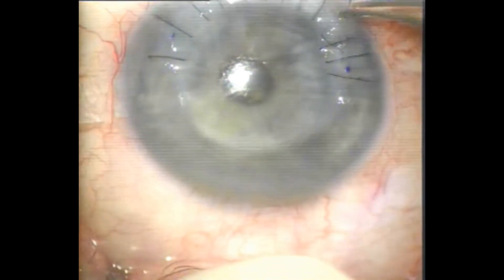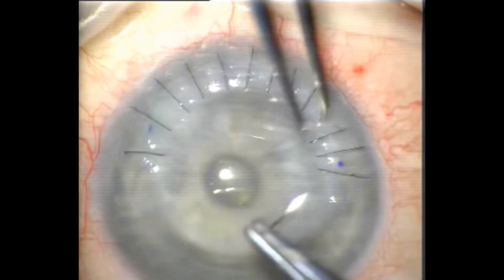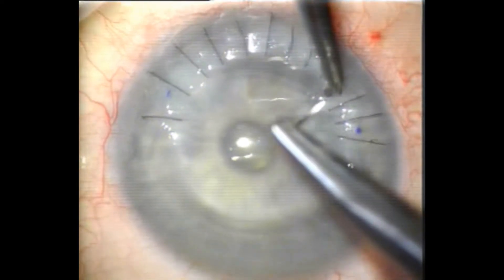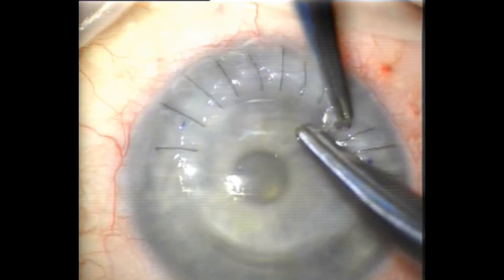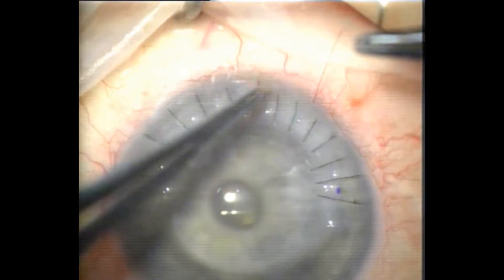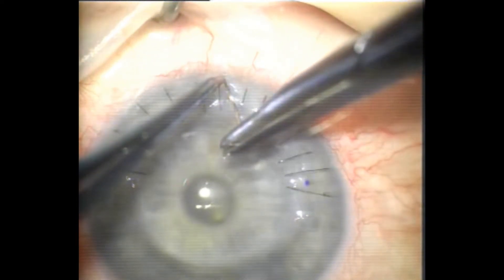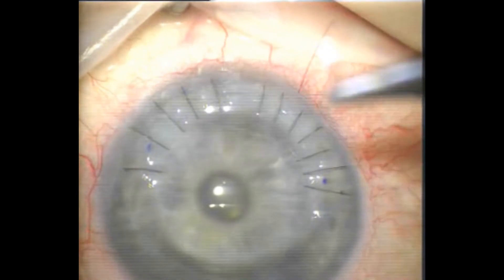Just burying the knots, removing the broken suture and replacing it. And that one at 6 o'clock is loose and I'm just going to remove that — cutting it with the tip of the needle and replacing it.